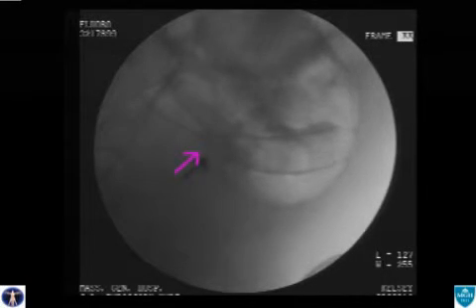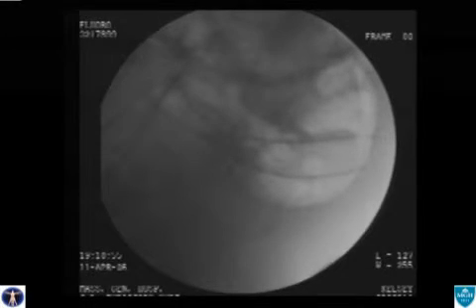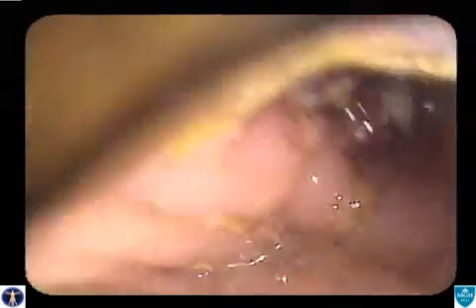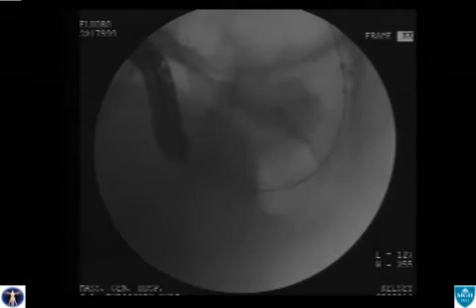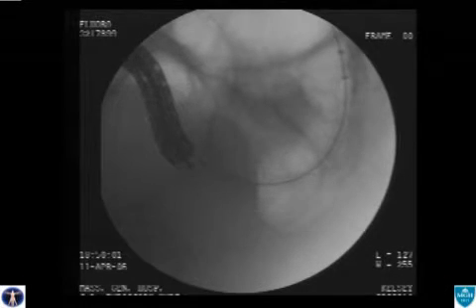It is acceptable that the stent slightly favors an upstream position relative to the midpoint of the stenosis, as colonic peristalsis will tend to shift the stent downstream slightly. Enteral stenting of the colon has been successfully used in a number of clinical situations. As in this example, the enteral stent decompresses the colon prior to resection of a malignancy, thus avoiding the need for a temporary decompressing colostomy.